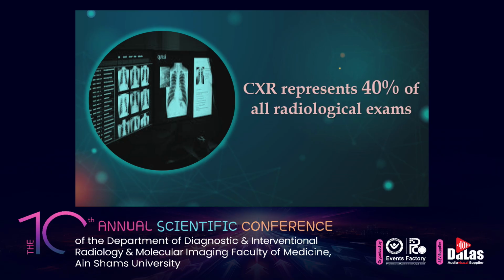Chest X-ray represents 40% of all radiological exams. If AI can help with a certain study, it will always be chest X-ray, to reduce the workload for the radiologists.